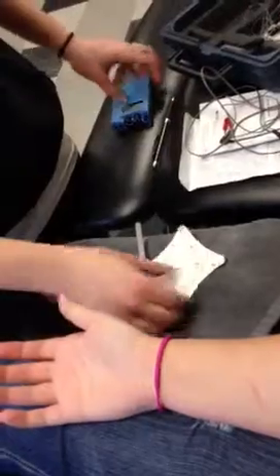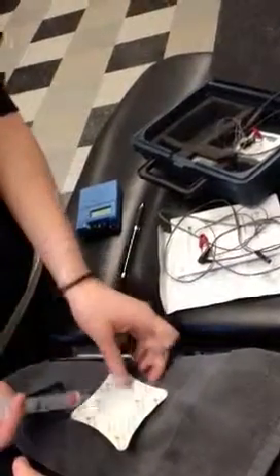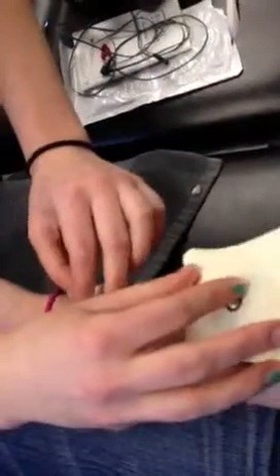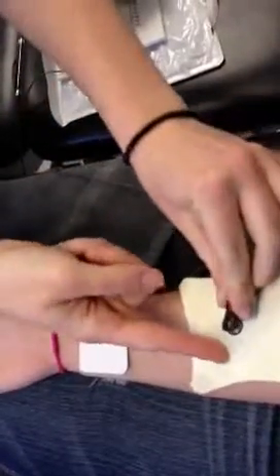Then you're going to find out your dosage. You'll take the needle — you shouldn't go over two of whatever medication it is — and then you're just going to put it on the pad. Put the pads on with the medication; they should be at least one pad width apart. Depending on the medication, you'll connect the wires: if it's a negative medication, you'll put it with a negative wire; if it's a positive medication, then you'll put it with a positive wire.